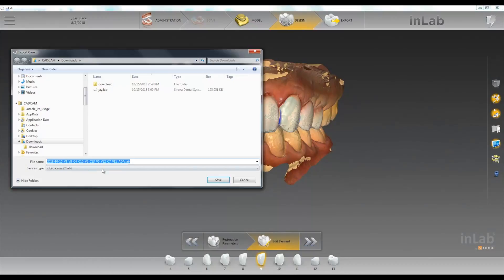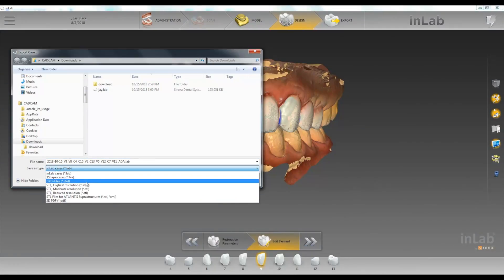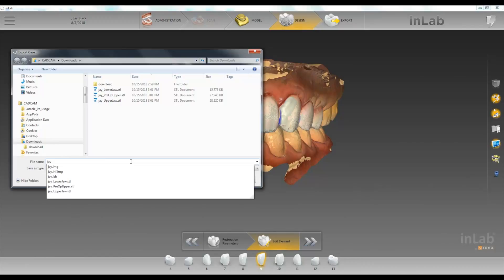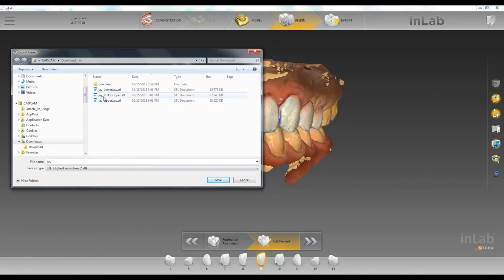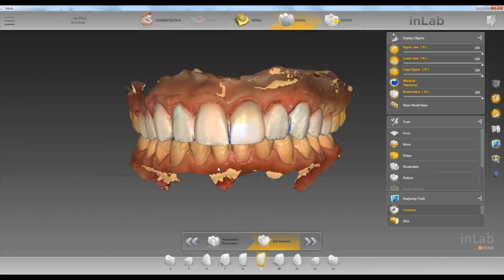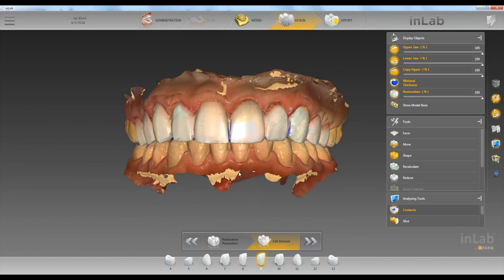We'll go and change this to STL high resolution, go ahead and change the name, and once we click save it's going to save all three models — so we'll have our lower jaw, upper jaw, and our pre-op upper, which is our biocopy. Now these STLs will not have bases to them, but they will be saved.